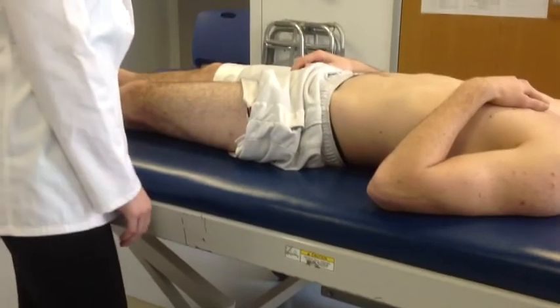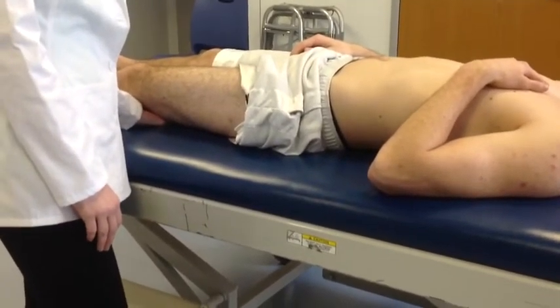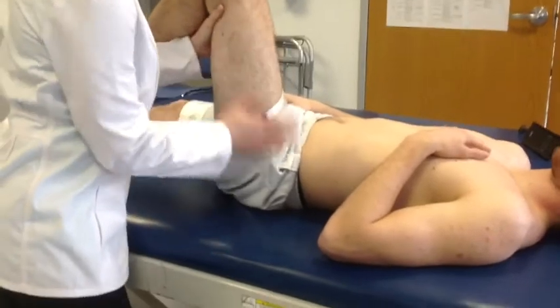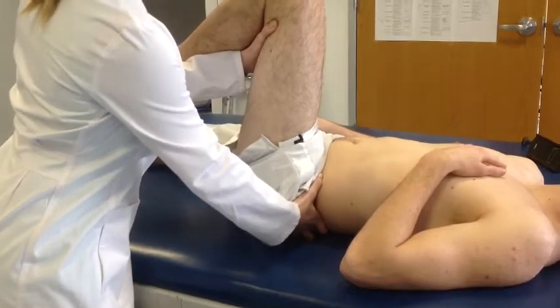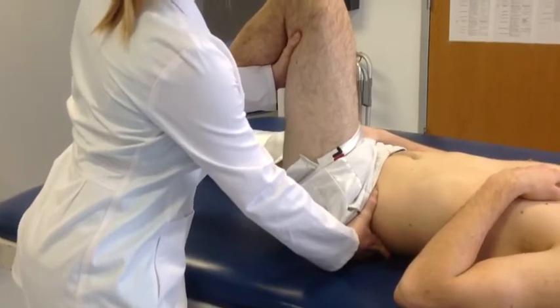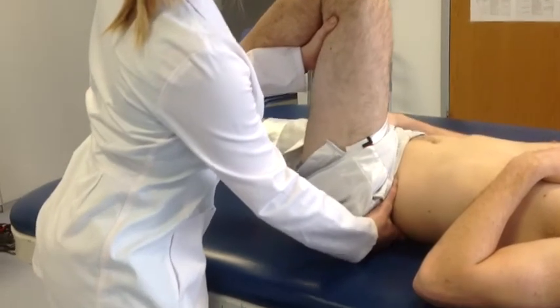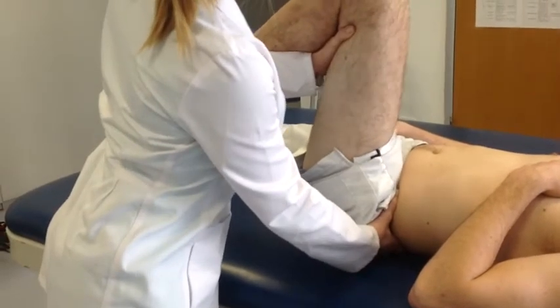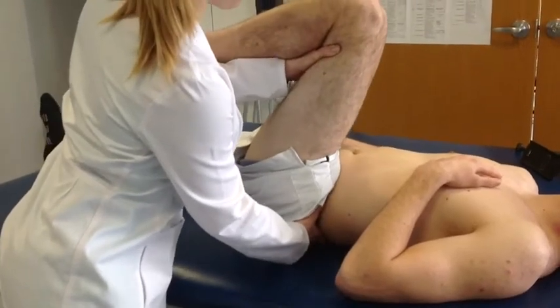To measure passive range of motion in hip flexion, the same test is performed but with the patient in a supine position. Flex the hip by lifting the thigh off the table, allowing the knee to flex passively during the motion to reduce tension in the hamstring muscles. Maintain the extremity in neutral rotation, neutral abduction, and neutral adduction throughout. The end of range occurs when resistance is felt and attempts to overcome it cause the pelvis to tilt, indicated by the PSIS going into your finger in the table.